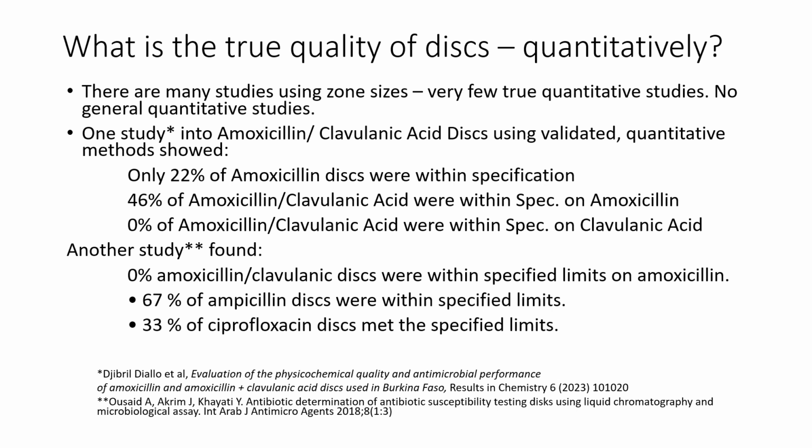But there are a couple more recent studies, and here is one which looked at amoxicillin clavulanic acid. And they found that only 22% of amoxicillin discs were within spec.